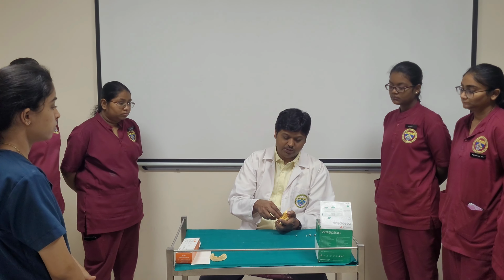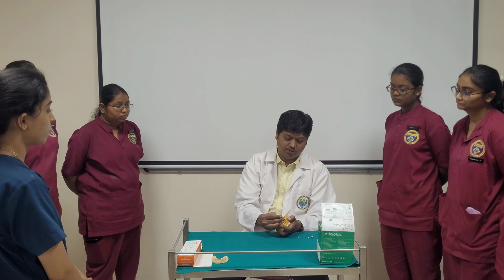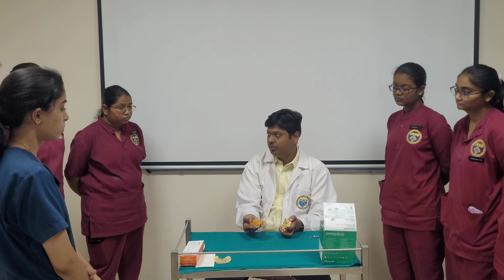Then once the impression is set, we will loosen it and unscrew it from outside, and your open tray should be picked up or it has to come out with the impression.